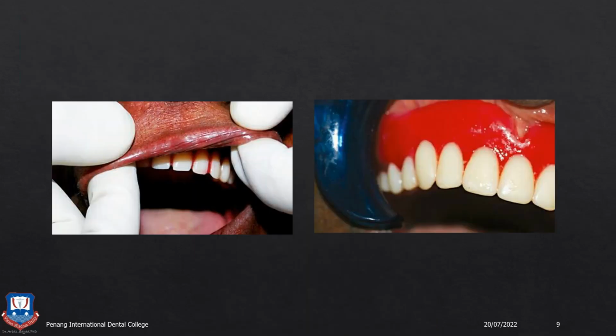Next, we insert the upper denture. We similarly check the upper denture for the peripheral border seals. You should be able to see the mucobuccal reflection. That is, the mucosal fold or the mucosal reflection from the vestibule should be visible. It should not be that the denture is pushing against the vestibule or the sulcus and you are not able to see the movable and the attached gingiva. So the mucobuccal fold has to be visible just above the denture border.